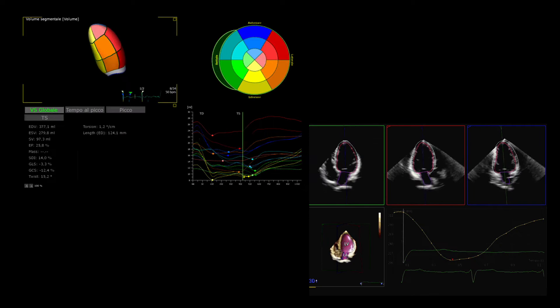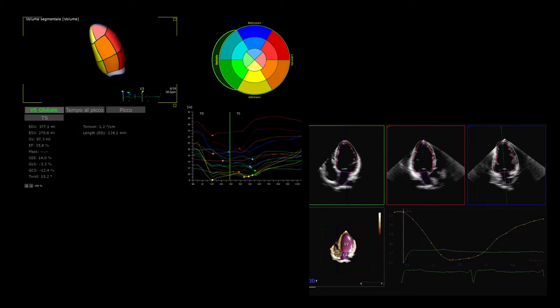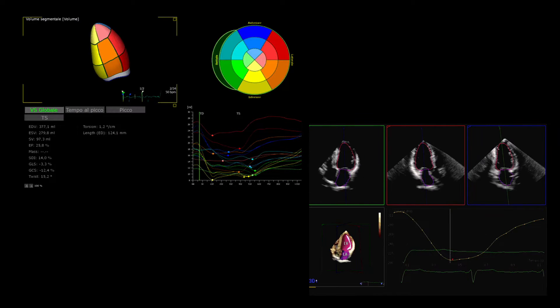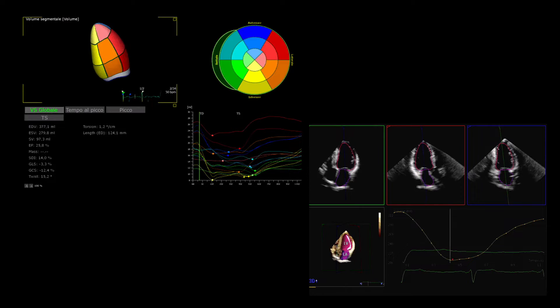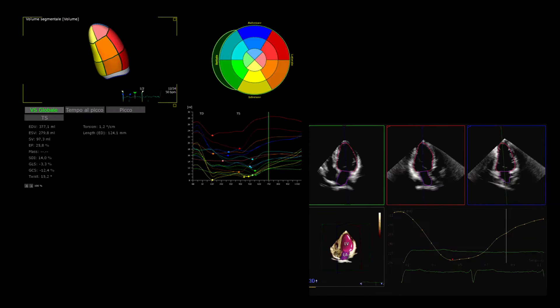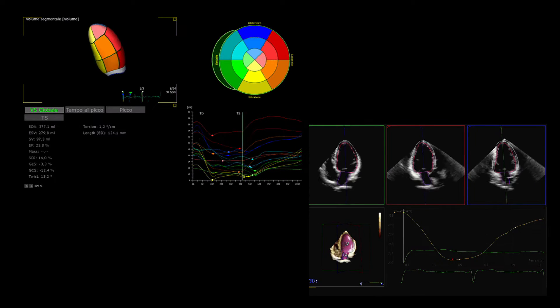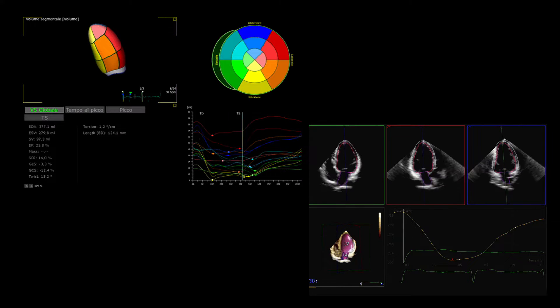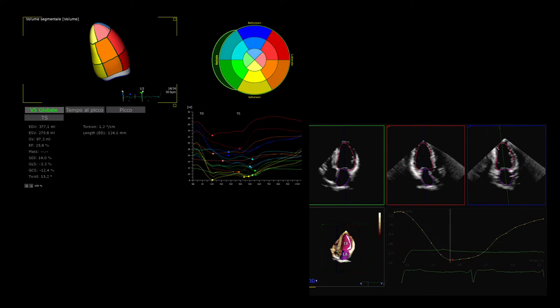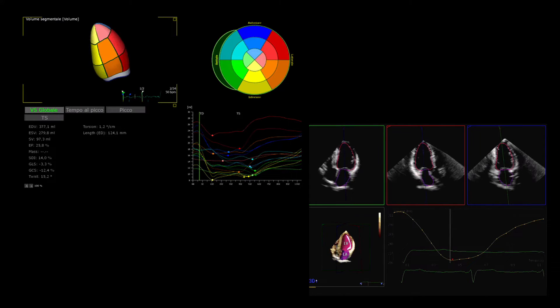With 3D echocardiography, only one acquisition is needed to obtain volumes and ejection fraction, and it provides the possibility for quantitative assessment of left ventricle regional wall motion by measuring the volume change of each segment in the cardiac cycle. It has been demonstrated to be more time-saving, reproducible, and accurate than conventional 2D echocardiography for left ventricle volumes, mass, and ejection fraction measurements, with lower inter- and intra-observer variability.